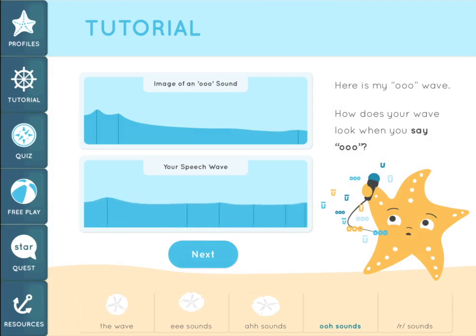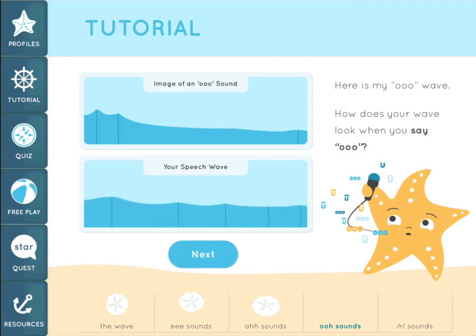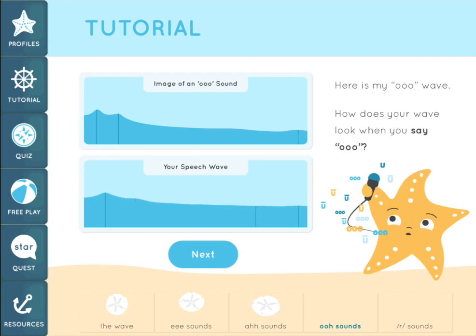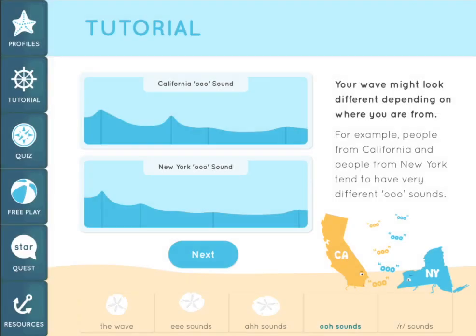Now I'm going to say OO. Like before, watch how the peaks in the wave on the bottom line up with the peaks in the picture of a wave on the top. OO. It's important to mention that the shape of your wave might look different depending on where you are from. For example, people from California and New York tend to have very different OO sounds.